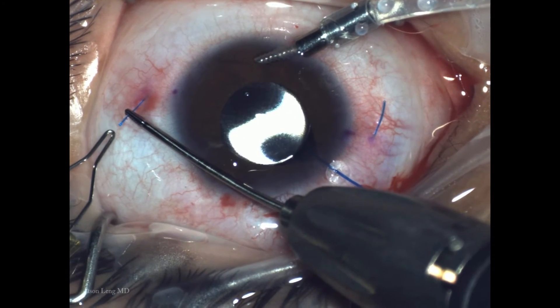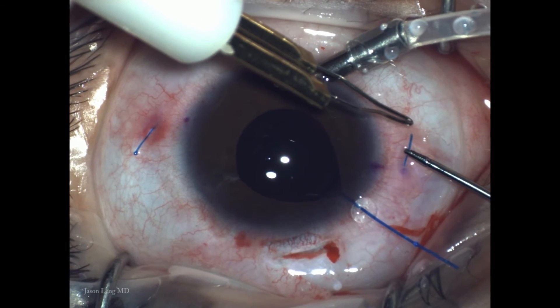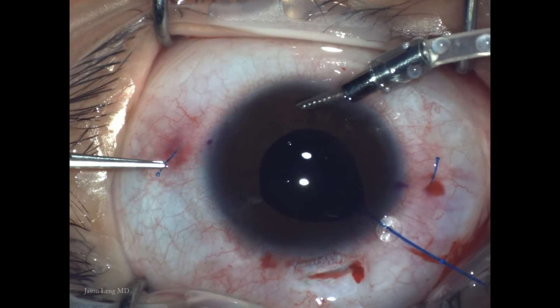Now I'm using a low-temp cautery to make a flange. It doesn't take much heat — it's better to err on the safe side, because too much heat will cause the haptic to shrink rapidly and get too short.